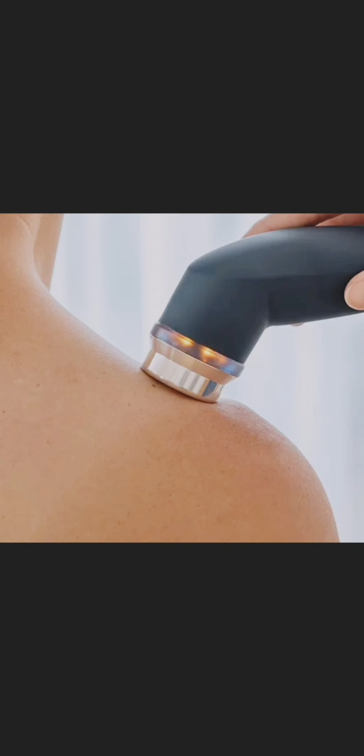Conducting media. A substance that facilitates the transmission of ultrasound energy by decreasing impedance at the air-skin interface. Characteristics of good coupling media: high viscosity and transmissivity for US, hypoallergenic character, acoustic impedance similar to human tissue, cheap, lubricant.